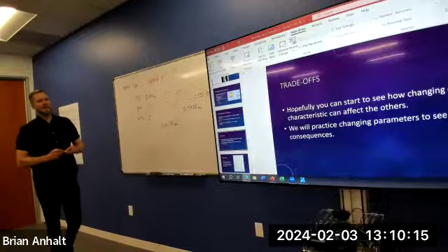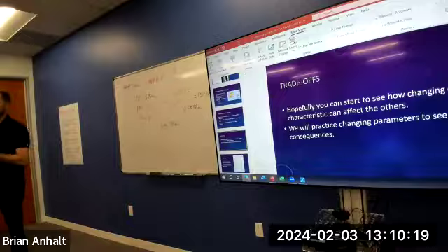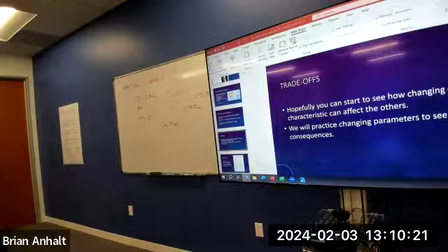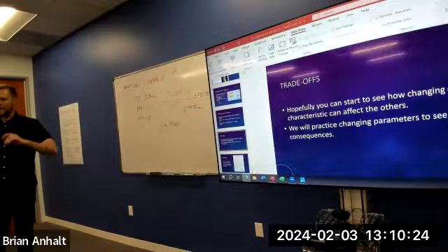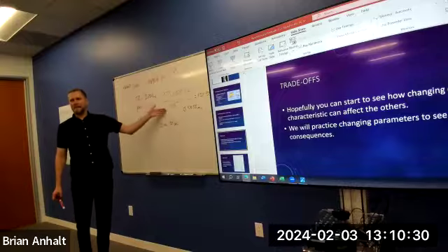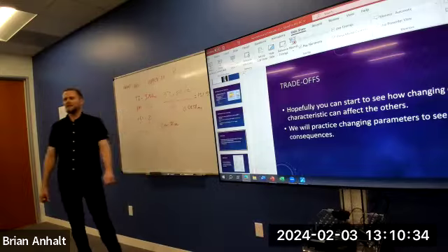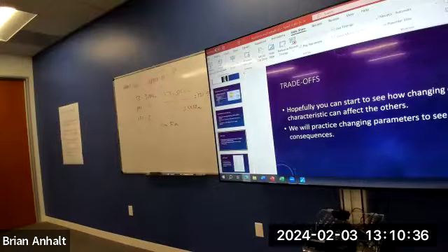Yeah, so sorry about that. I'm trying to use imaging you as best as possible because it does help to some degree, right? Getting you kind of used to at least what we're talking about before I blast you with all this crazy stuff. But yeah, they are talking about fast spin echoes, which we won't get into. So for now, scan time does not include echo train length, because you'll need to know what a fast spin echo is and what echo train length means and how we generate that before we can even talk about it.